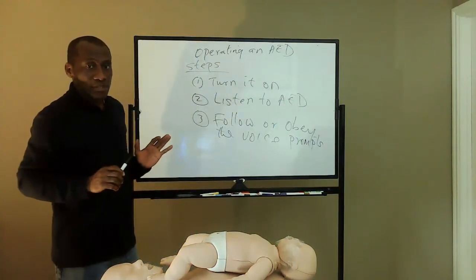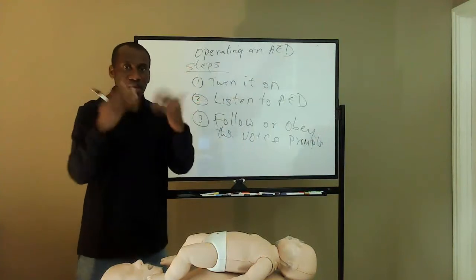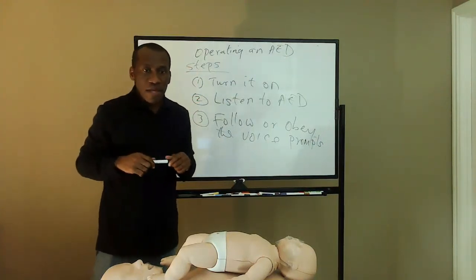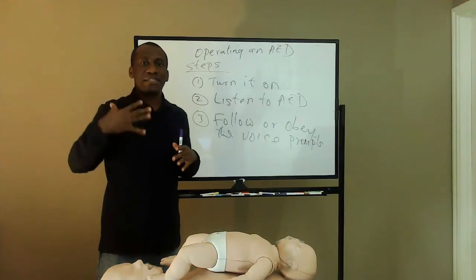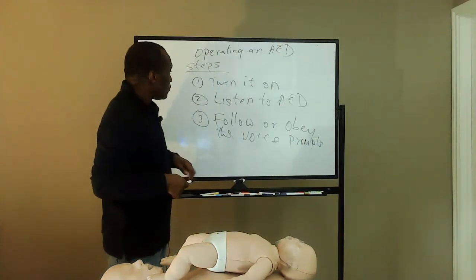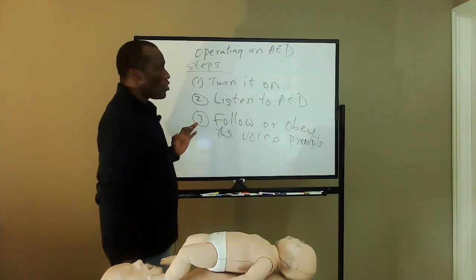Very, very important. All you need to do is listen, and also watch. Look at the pad as well, because on the pad you have the arrow indicating where to place it on the patient's chest. So turn it on, listen, follow, and obey. All right, so I will show you.